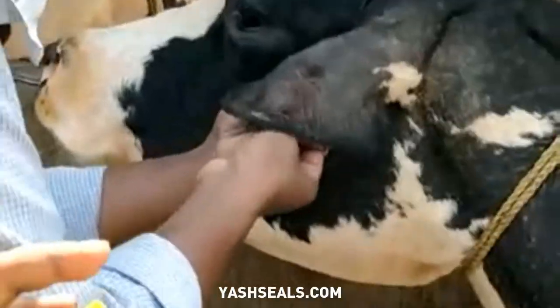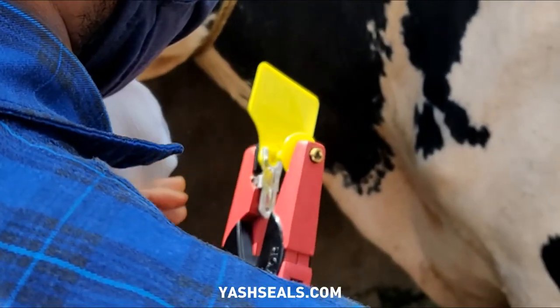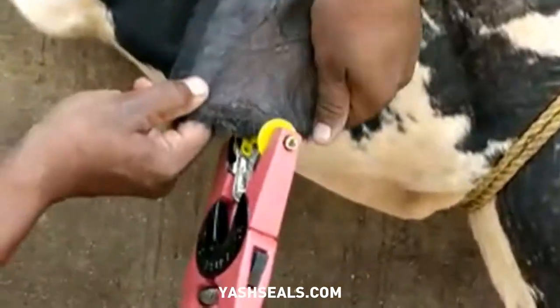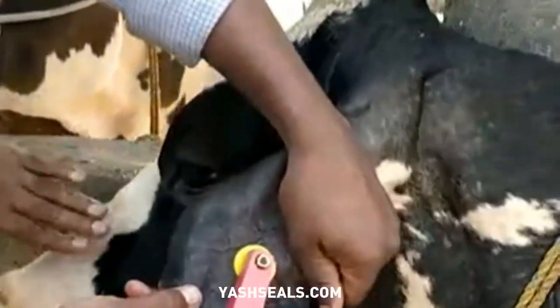Apply antiseptic liquid on the cattle's ear. Squeeze the jaws together lightly to ensure the male shaft is in line with the female. Apply by squeezing the applicator with one fast action.